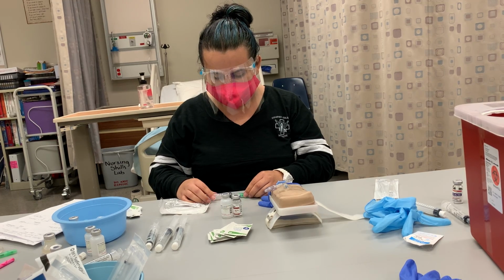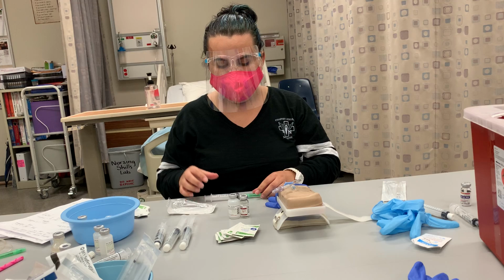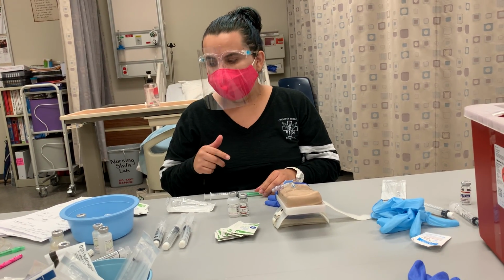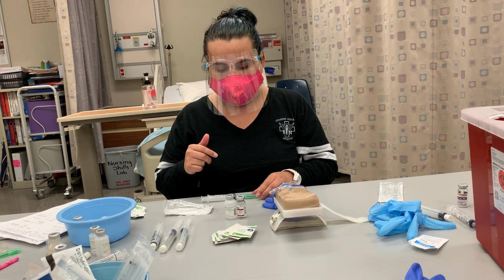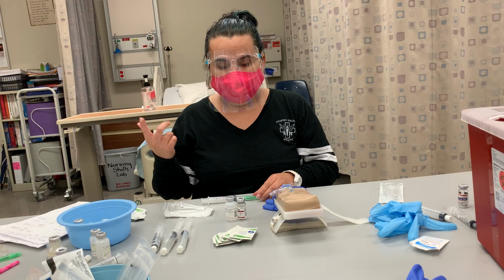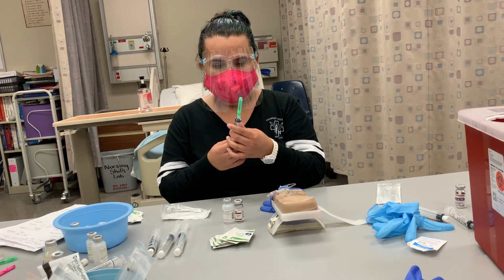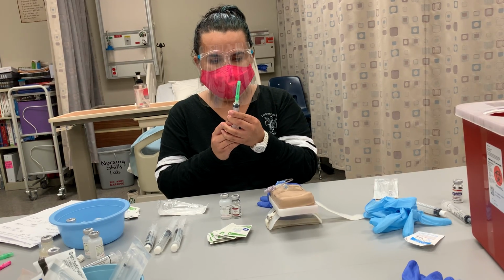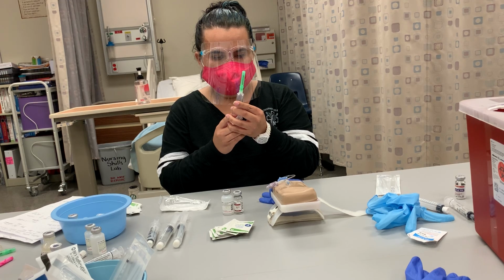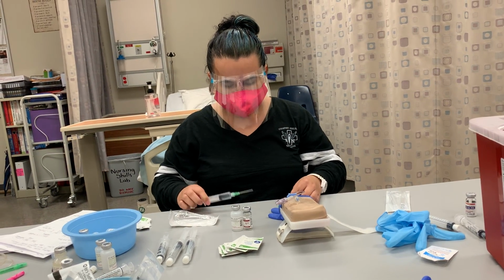Okay, now because I'm going to be adding air into my normal saline first, and since I am going to be giving 5.2 mLs of normal saline, I want to apply 5.2 mLs of air.